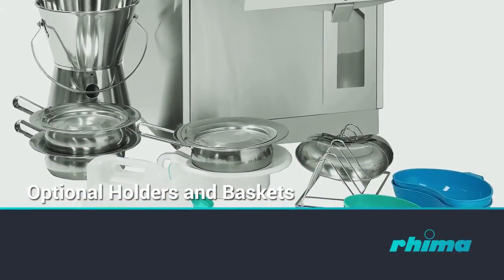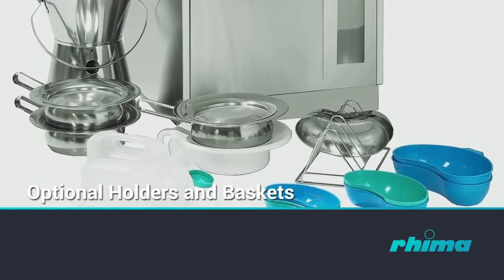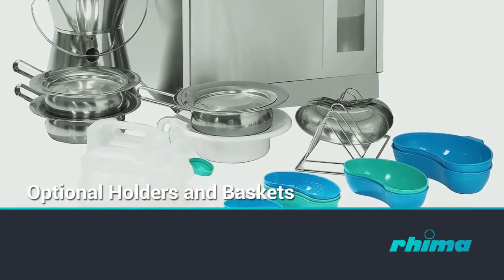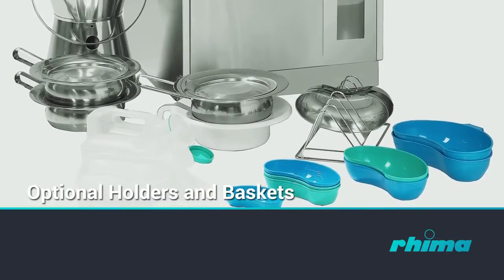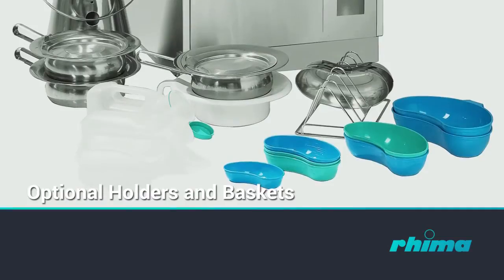Using optional holders and baskets enables the correct positioning and easy loading of various items, e.g. suction jars and medicine pots, and extends the Deco 190's capacity and versatility.